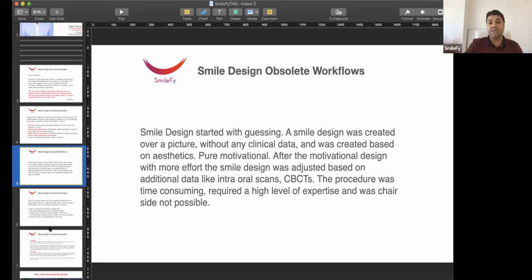We cannot do anything in 2D and translate it into 3D, because the limitation of the way 2D shapes are visualized in the 3D space cannot just be ignored, right? And dentistry is a precise science. I call it science, so that's why we need to create something else which is more precise.